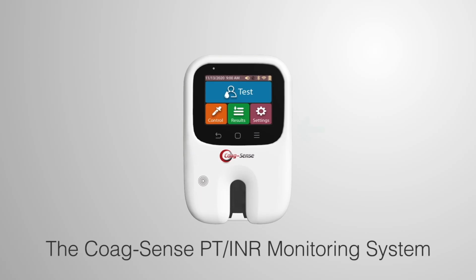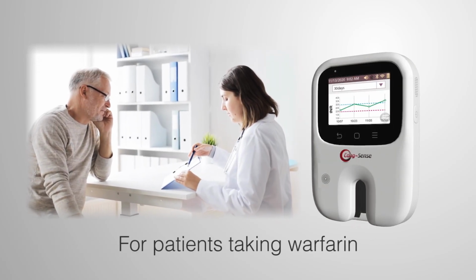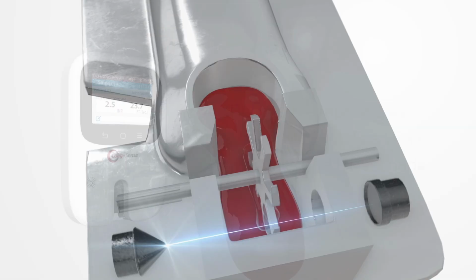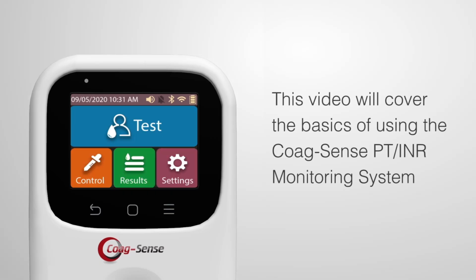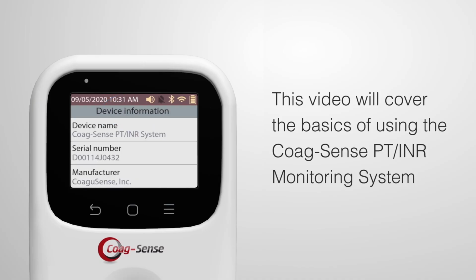The Coag-Sense system is used to test prothrombin time, PT, in patients taking warfarin for oral anticoagulant therapy. Results are reported as International Normalized Ratio, or INR units, and PT seconds. Since the system directly detects the clot formation, it reports true PT seconds, offering lab-quality results from the convenience of your home. This video will cover the basics of using the Coag-Sense PT INR monitoring system.